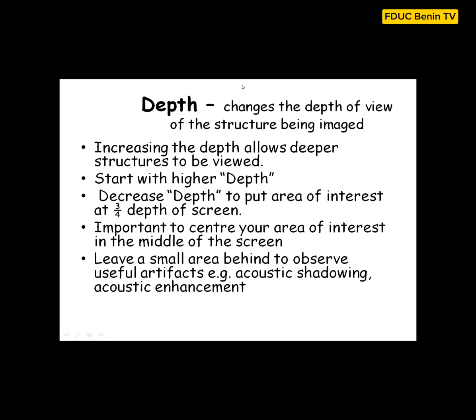And again, as I said earlier, it is this knob that will help you to fit your image, or your area of interest, the structure you are imaging, to fit the screen properly. You don't want the image to be too big or too small. For example, if you are imaging the femur, you don't want it to be so small. You want it to occupy like 3/4 of the screen. So it is this depth button that will help you. All you need to do is increase the depth. It will allow you to see deeper structures very well.